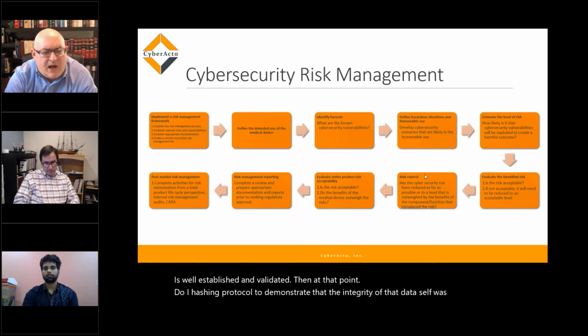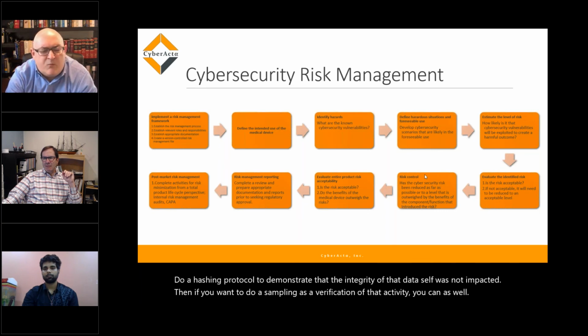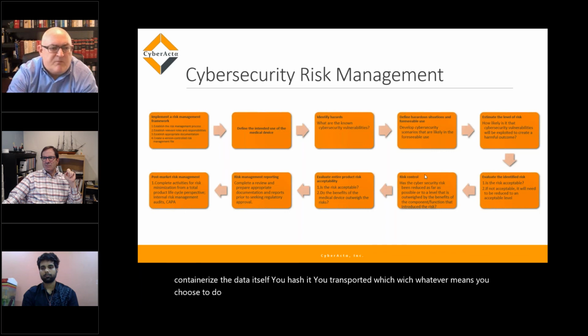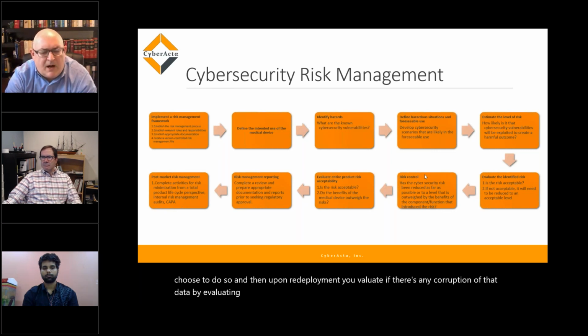And then if you want to do a sampling as a verification of that activity, you can as well. But the way that we would recommend to our clients is you containerize the data itself, you hash it, you transport it, by whatever means you choose, and then upon redeployment, you evaluate if there's any corruption of that data by evaluating the hashing algorithm, and then at that point you're good to go.